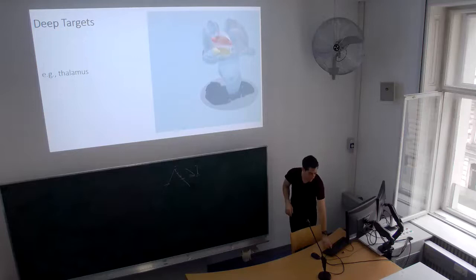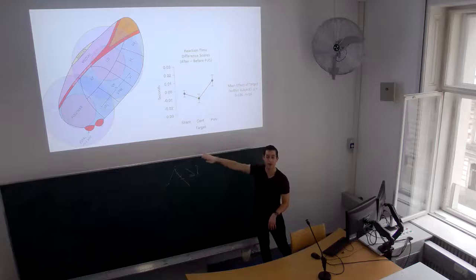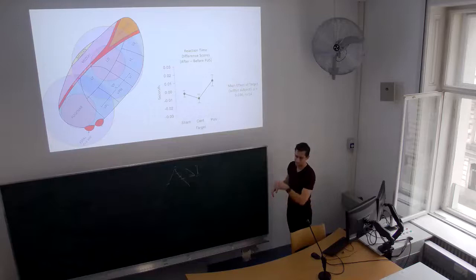Now, because the skull is important, there is some added variability. So it doesn't really look like that. It's more like this barely overlapping, probabilistic cloud of influence, I call it. The darker inner circle is where the idealized focal point is, and this larger circle is me adding what I know about the variability concerning bone, targeting, the software, all of that. So it's something like this, but it's accurate enough in theory that I thought we'll do this, that I'm doing a study with this design.